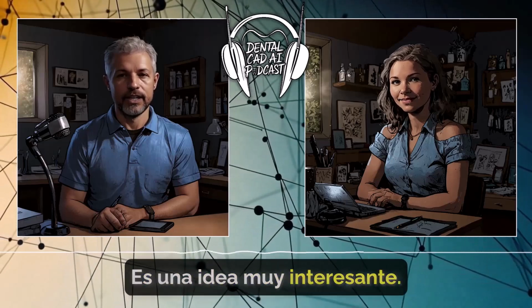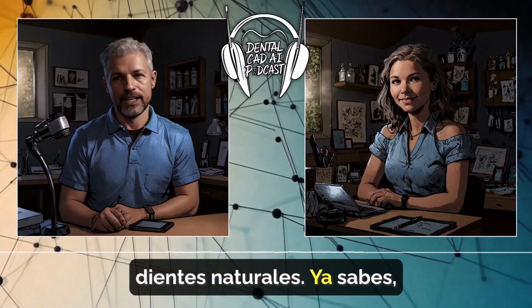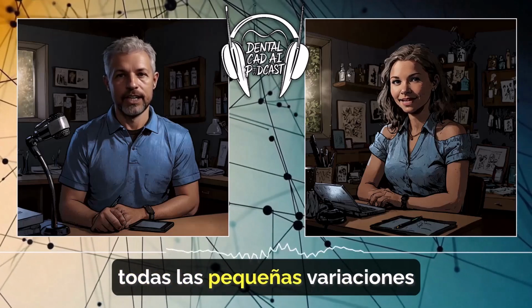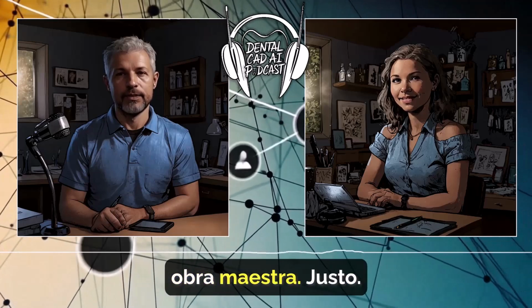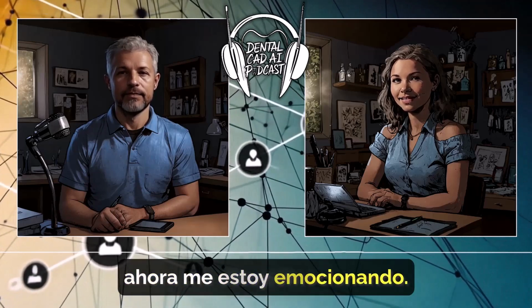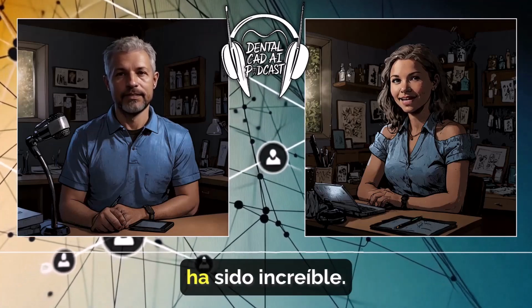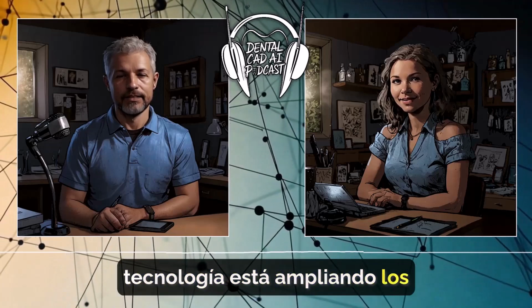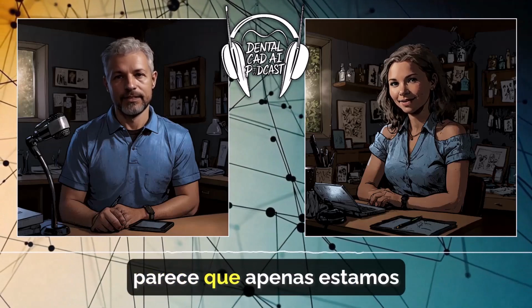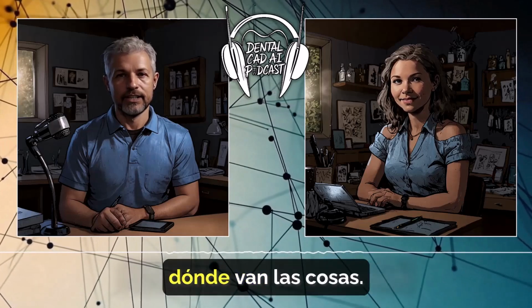That's a really interesting thought. Like restorations that perfectly match your natural teeth, with all the little variations and nuance. Like a sculptor creating a masterpiece just for your mouth. Okay, now I'm getting excited. Seriously, this whole deep dive into Elefsina has been incredible. It's amazing to see how technology is pushing the boundaries in dentistry, and it feels like we're just scratching the surface. I totally agree. It's really exciting to see where things go from here.